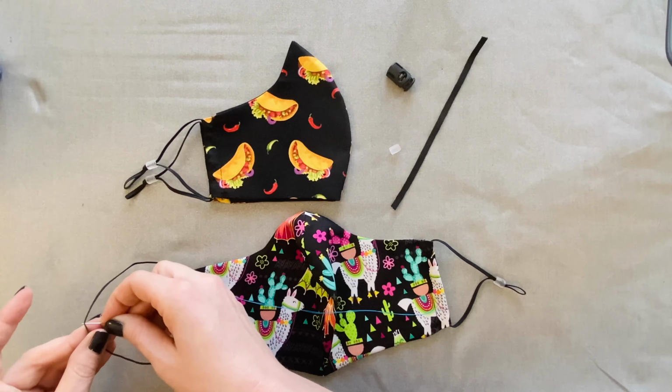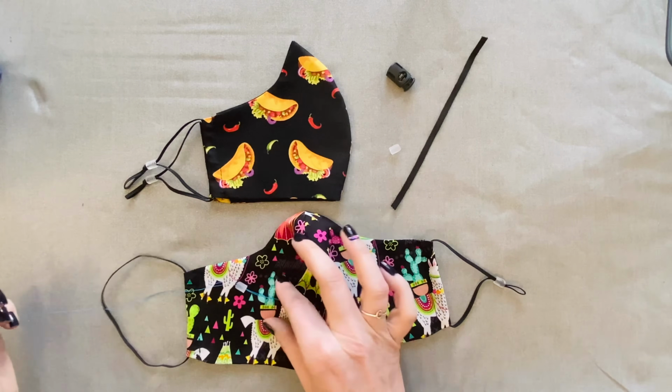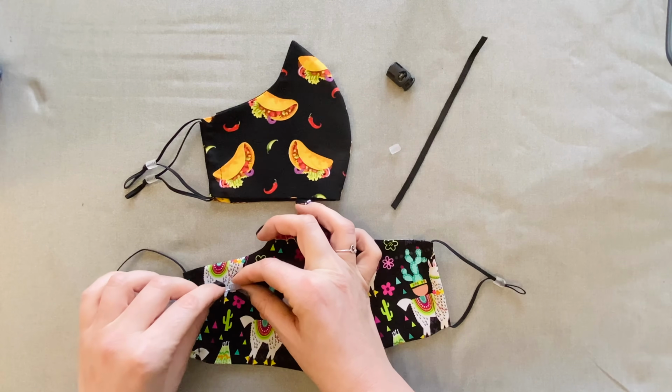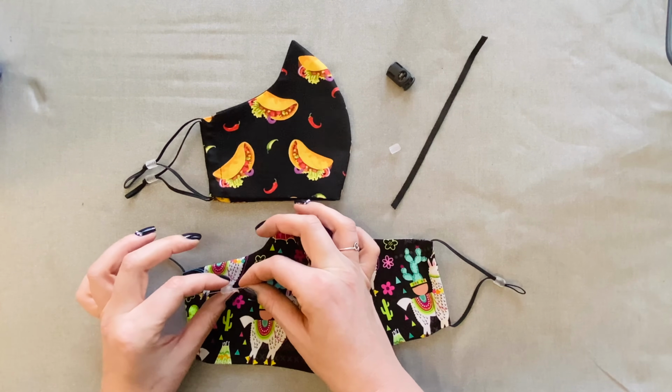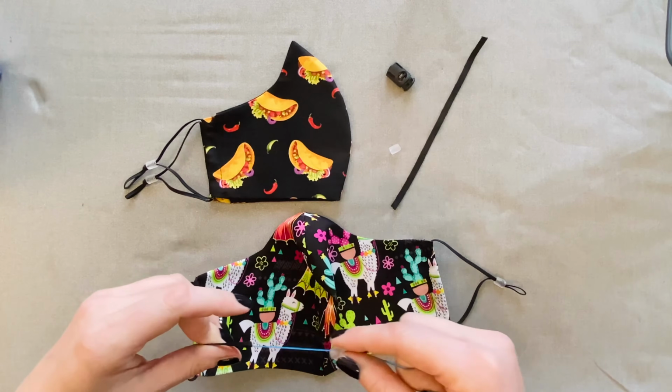I am going to pinch through this. Now don't let this end go through. I want to keep it there. I'm going to go back through the hole, like so. So I'm going to hold this up close just so you can kind of see what's going on.